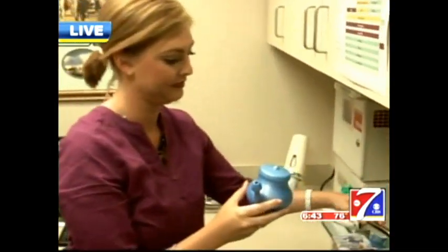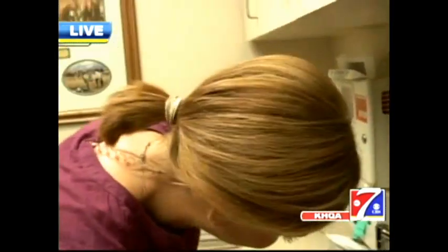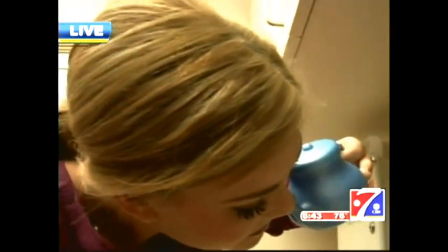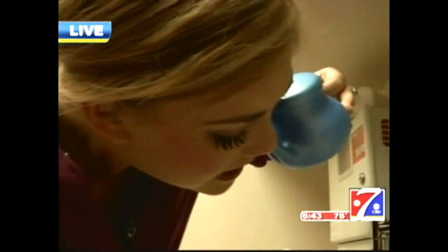As she does this, she's going to kind of lean over the sink. You want to get your forehead at about the level of your chin, and then open the mouth slightly. Then you want to insert the end of the neti pot into one nostril and gently lift the neti pot to increase the flow of saline solution.